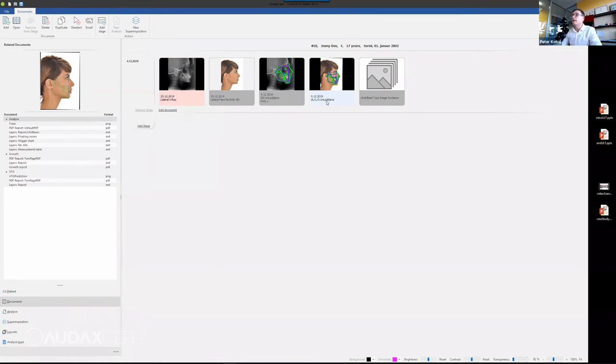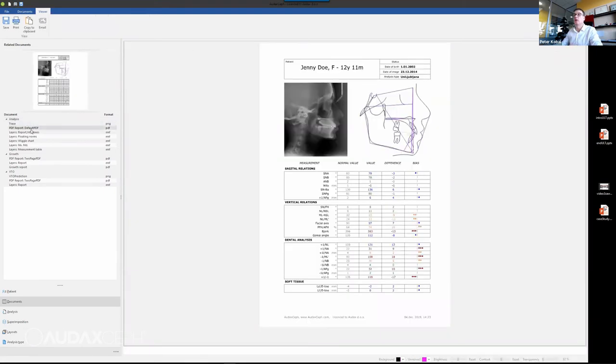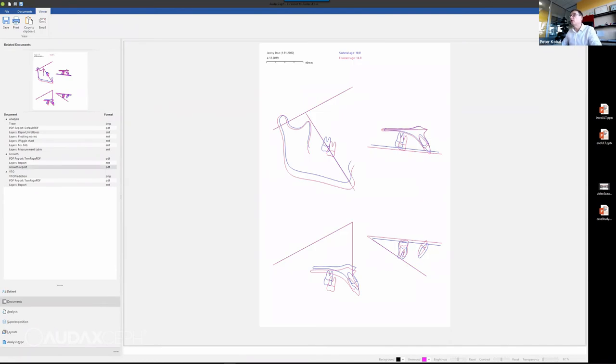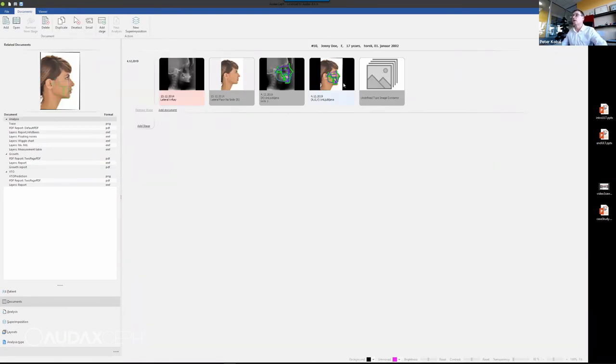This is something that has analysis, growth, and VTO inside this document, and several different documents attached. So what we have is the document, the report, info box, and some growth documents here as well. For example, I showed you that before. We have also some VTO reports, and this is everything which is connected to that analysis automatically.